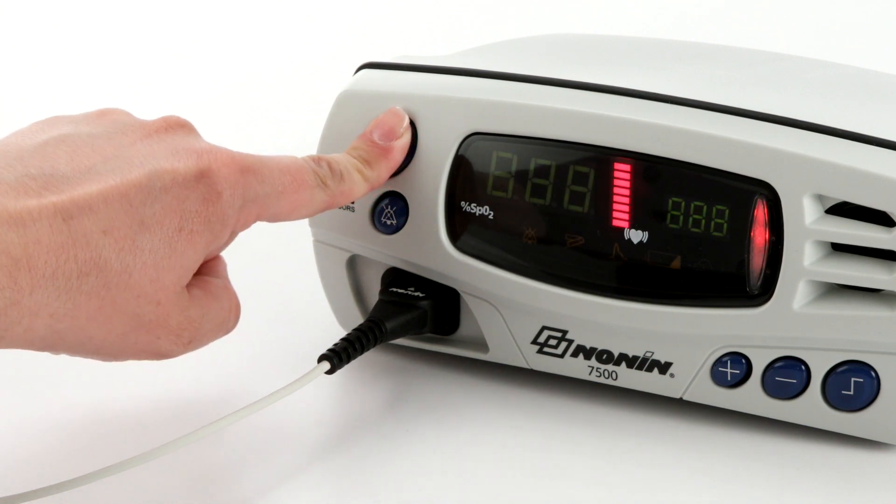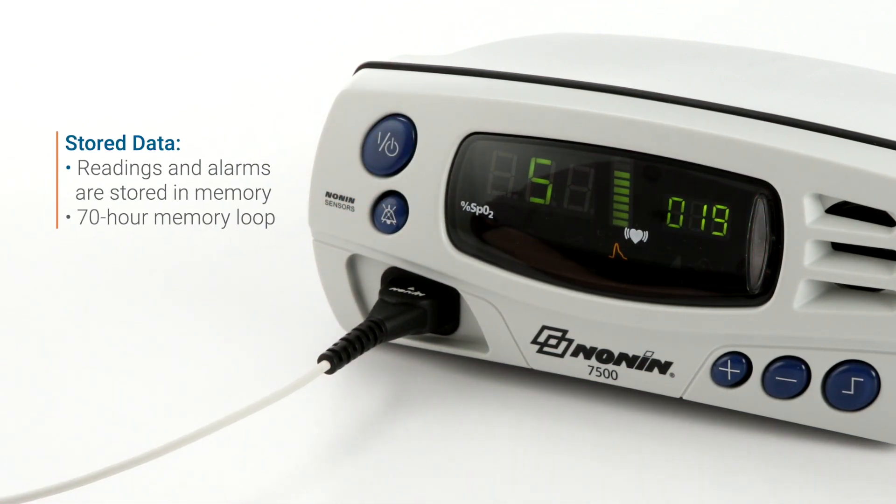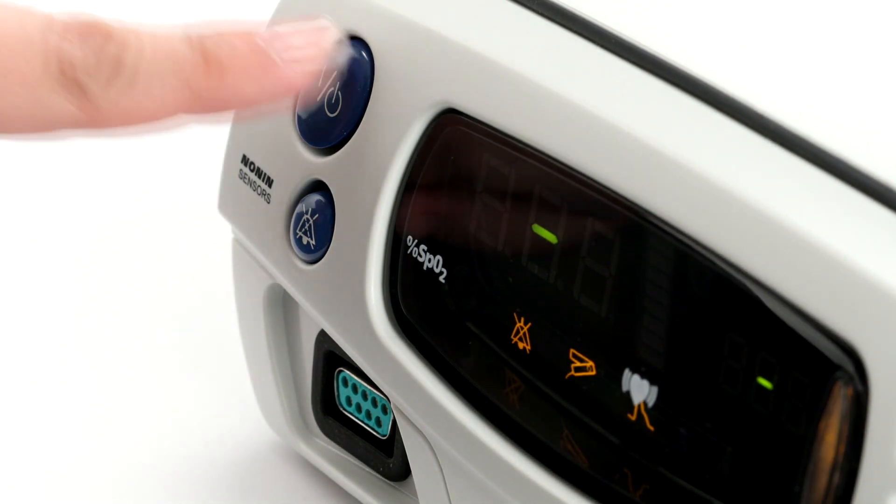Stored data is retained for the last 70 hours of use and then records over the oldest data in four-minute segments. Data can be downloaded and analyzed on NANAN's Envision software. When you're ready to stop using the oximeter, simply press and hold the on-off button until the oximeter turns off.